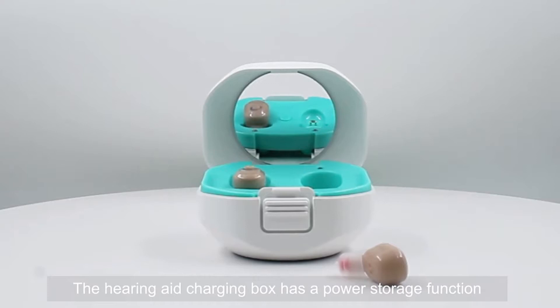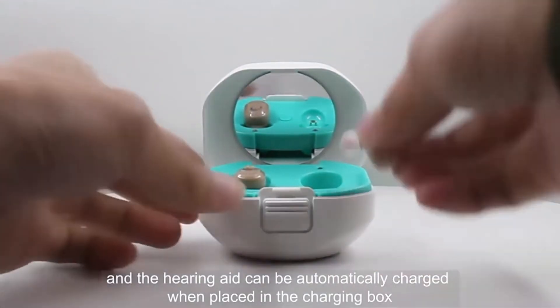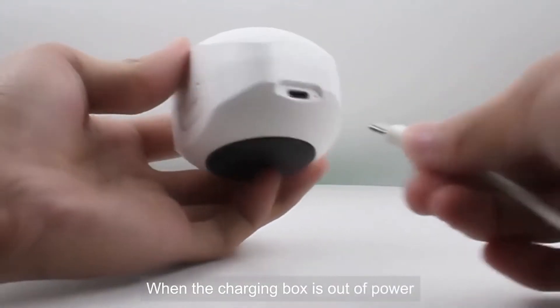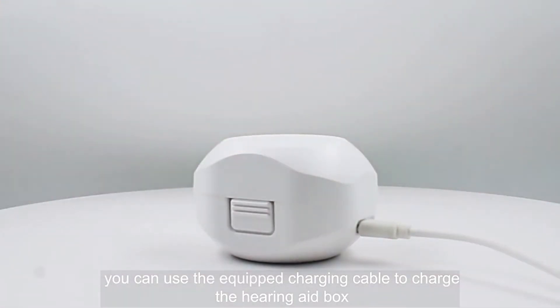The hearing aid charging box has a power storage function, and the hearing aid can be automatically charged when placed in the charging box. When the charging box is out of power, you can use the equipped charging cable to charge the hearing aid box.